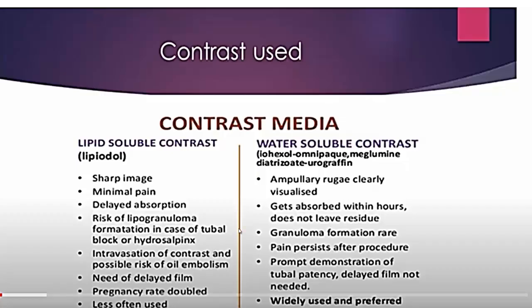This slide I used to put, but nowadays we don't use lipid-soluble contrast, here in Egypt especially. It's not so much available. But long ago, the gynecologists usually needed Lipiodol, because they say that it has a therapeutic effect compared with the water-soluble contrast. So how do we differentiate between lipid-soluble contrast and water-soluble contrast?